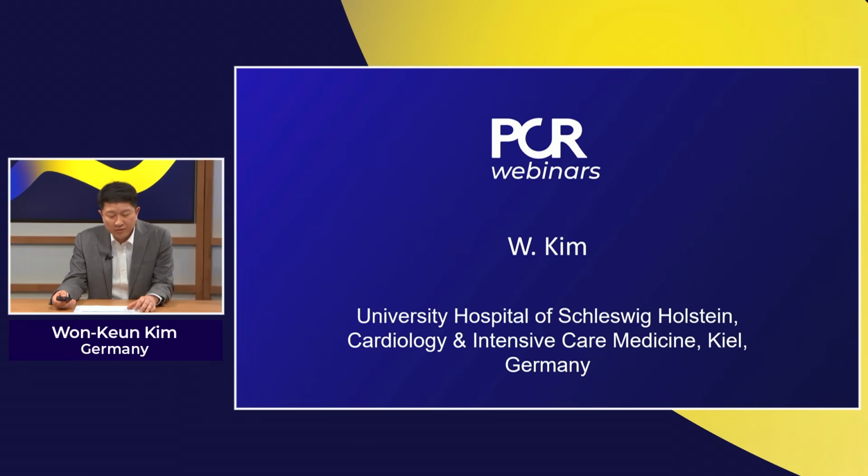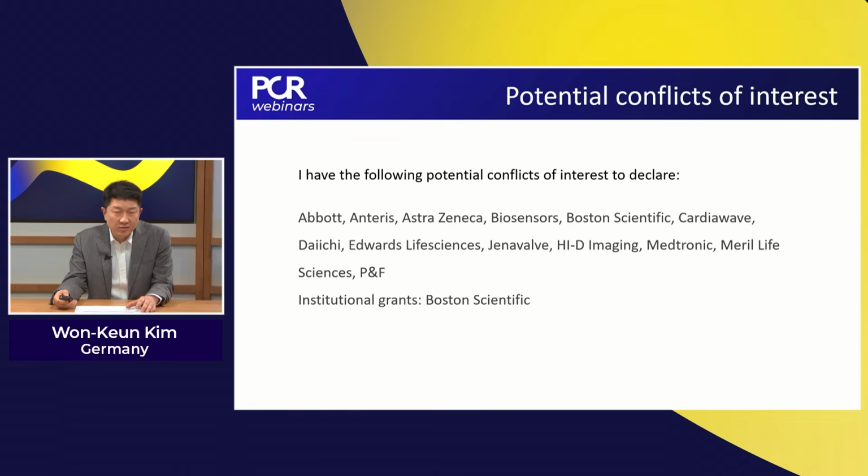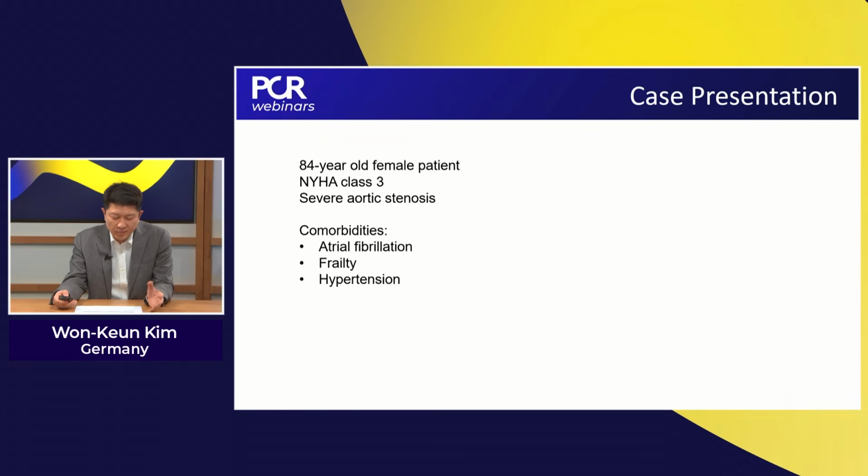Won, you also brought an exciting case and an educational case, I would say. Yes, thank you very much. And I think this case aligns well with our main topic of difficult deliverability. In this case, you will see that the femoroiliac vasculature is okay, but the main problem is more downstream in the vasculature. We know that even difficulties in the aorta can compromise delivery.